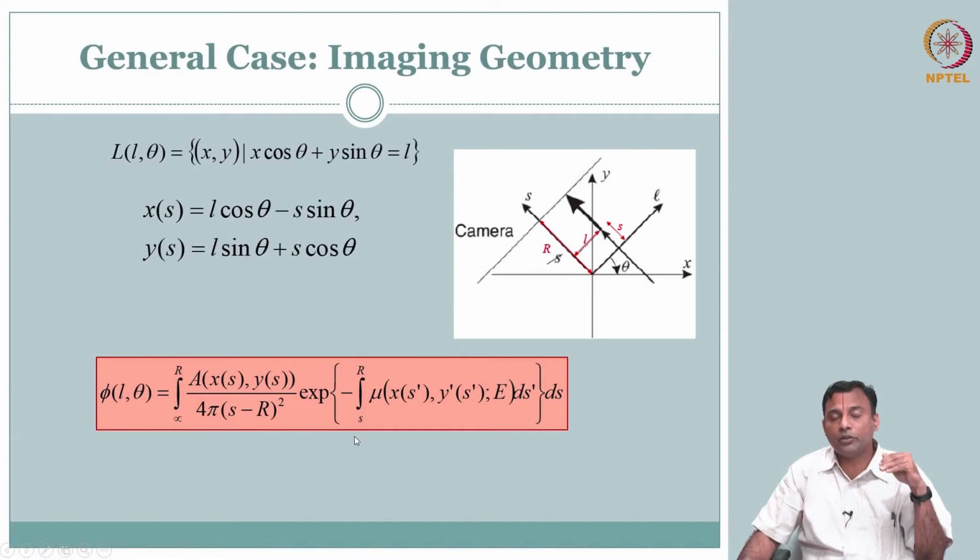See, in the whole of X-ray projection radiography and X-ray CT, we were only going after this one. We had this equation, and we were going after only one unknown. Now, you have two unknowns. I am actually interested in going after radioactivity. I am not really interested in mu now, but it is also an unknown. So, this is very tricky. How do you solve the problem? Well, I need to have some additional information. If I can have additional information about mu, maybe I can solve for this. So, you have two unknowns.